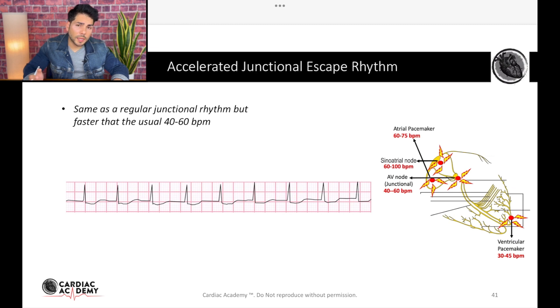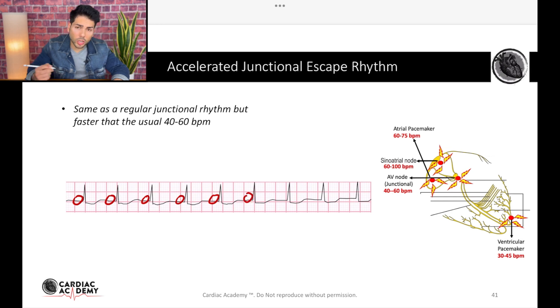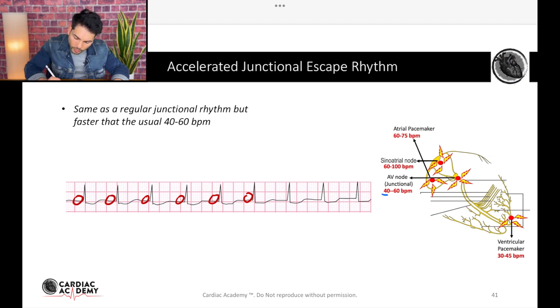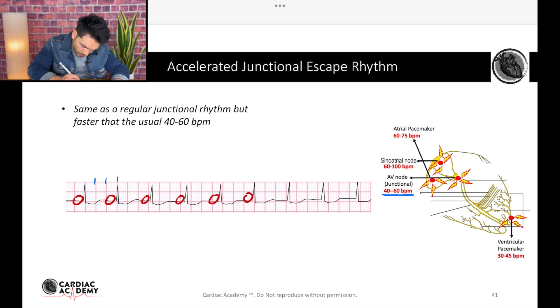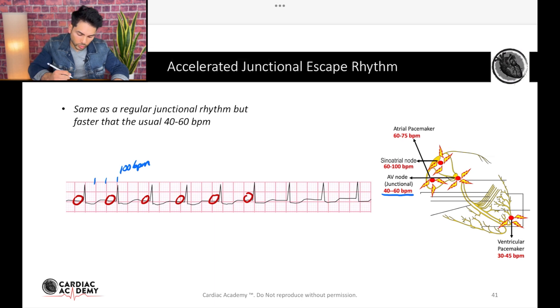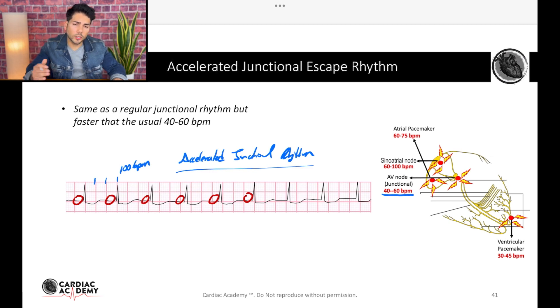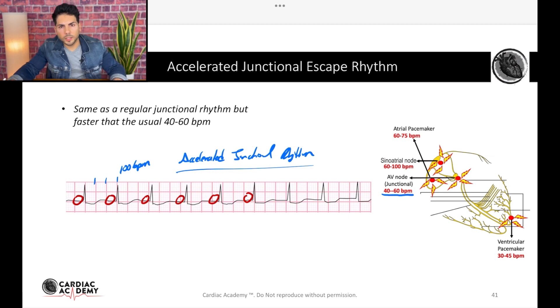Sometimes you will see rhythm strips in which you won't see P waves — like in this example, no P waves — so that tells us it's junctional. However, it's faster than usual. The normal junctional escape rhythm is 40 to 60. Let's calculate this one: 300, 150, 100 — it's 100 beats per minute. So it's faster than it's supposed to be. In this case, it's still a junctional rhythm, but it's an accelerated junctional rhythm — still junctional, faster than usual: accelerated junctional rhythm.